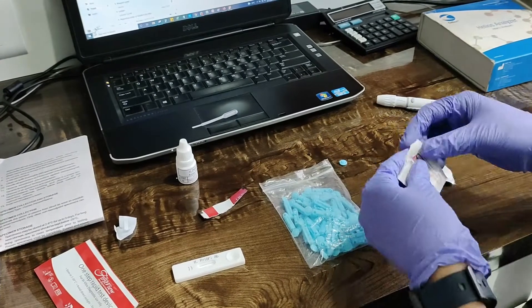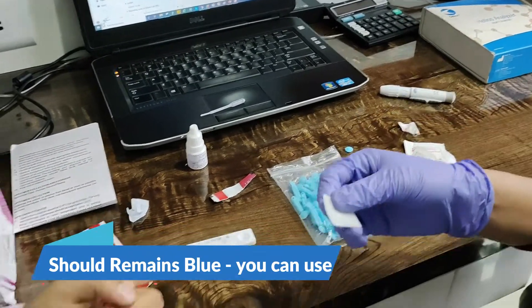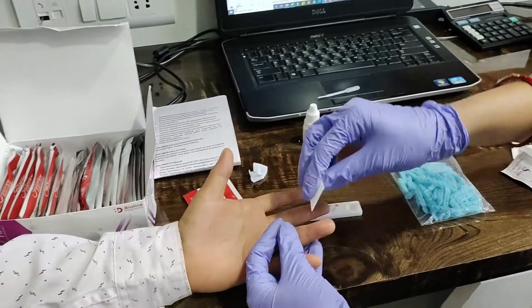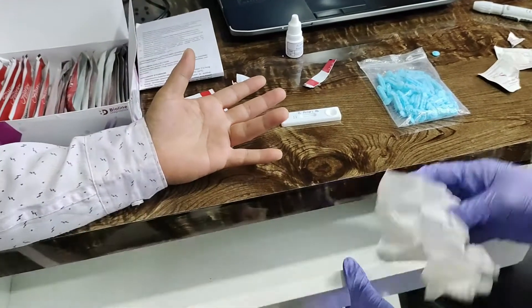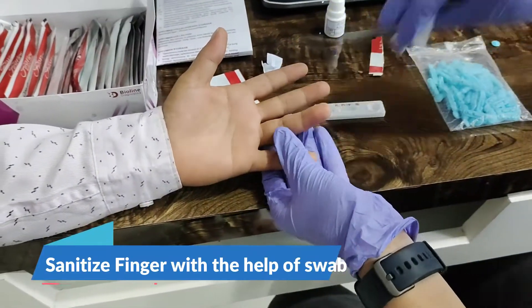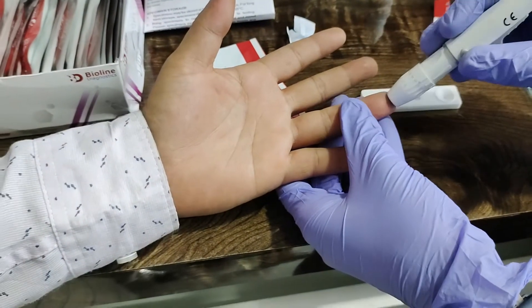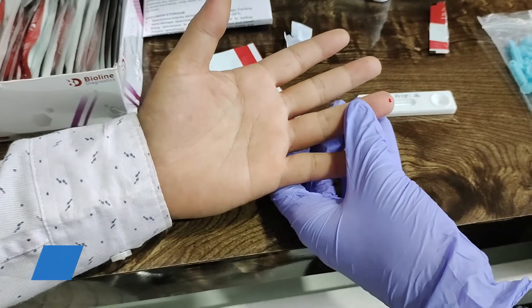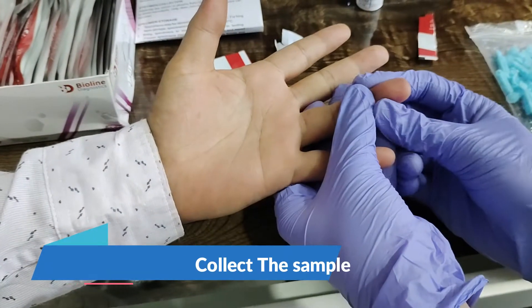Now we will collect the sample. We will wipe the finger with alcohol tissue, leave the area, and then we will prick. The first drop of blood we discard, and now we will take 20 µL of sample.